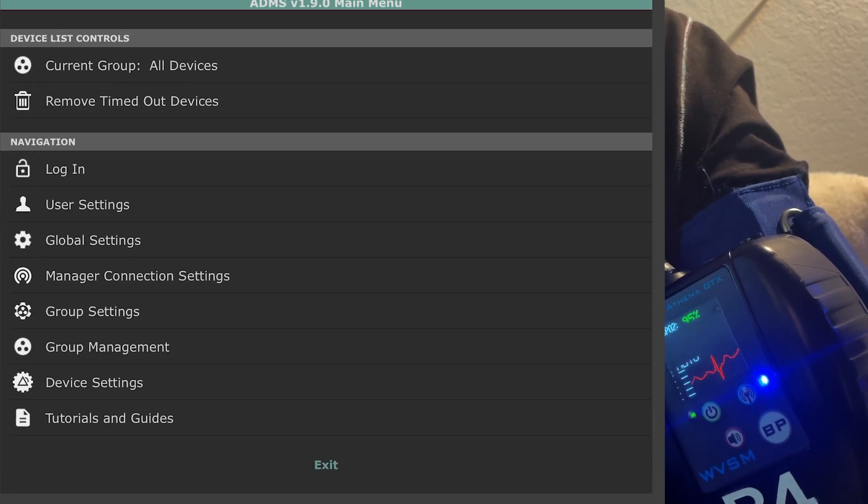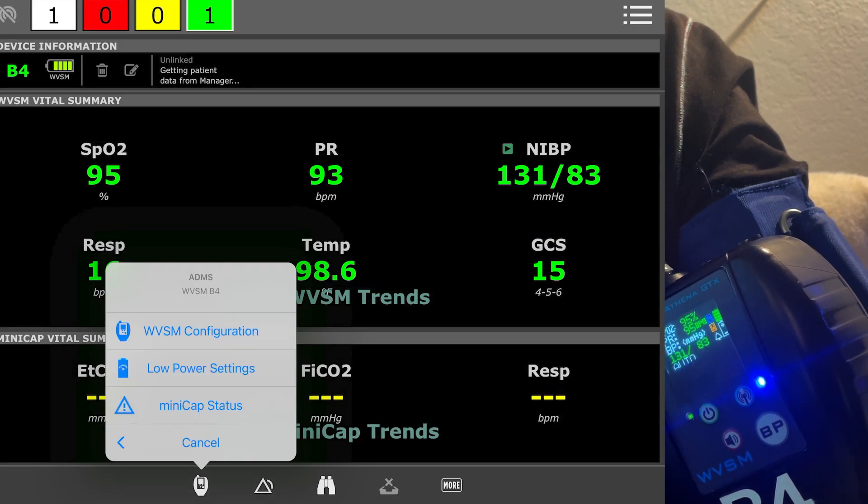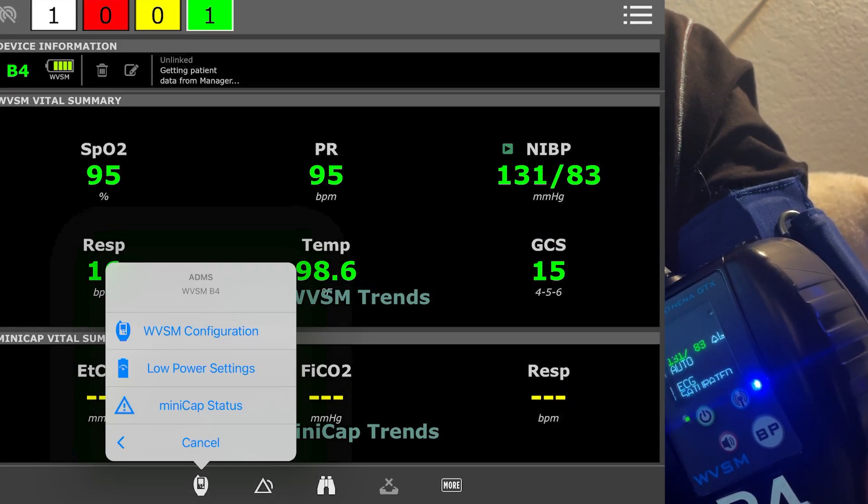So it's a pretty cool device — I'm pretty impressed with it. I'm excited to see how it integrates with the mini cap; I'll see if I can get hands-on with one of those at some point.